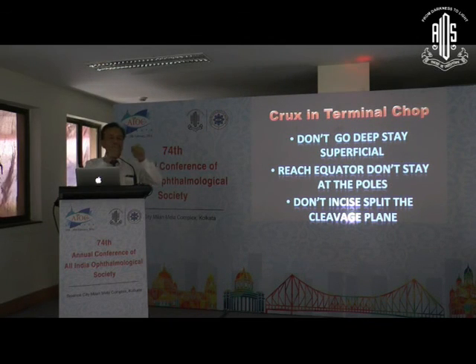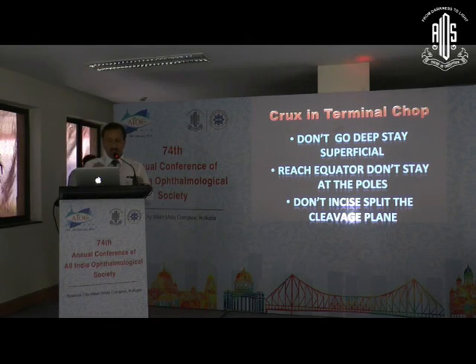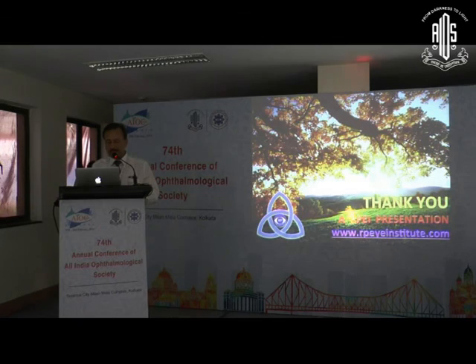And with the lateral separation force, it's so simple, even the hardest of hard cataracts you can very simply segment. Within a second or 2 seconds, you get the complete segmentation of the nucleus, and then you can very simply emulsify the nucleus. So one should try and use this technique, which is very, very good and would be very useful. Thank you.